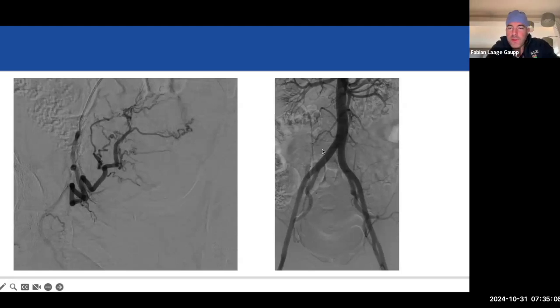And now, if you do see an ovarian artery supplying a significant portion of the uterus, you then have to consider, should I embolize it? The way I was taught is that if you were to see 2 ovarian arteries, you could consider embolizing one of them. But you want to be careful with embolizing all 4, because then there's a higher chance of necrosis. So I think typically what people do is if you do see bilateral ovarian arteries, you consider embolizing one of them.